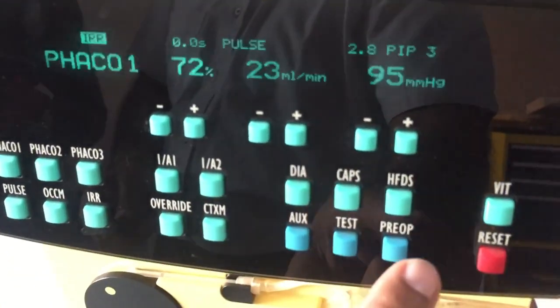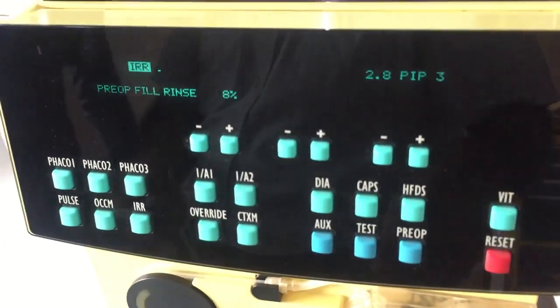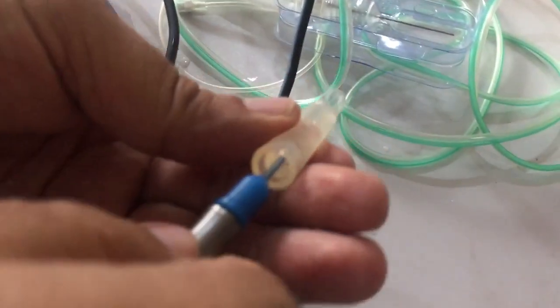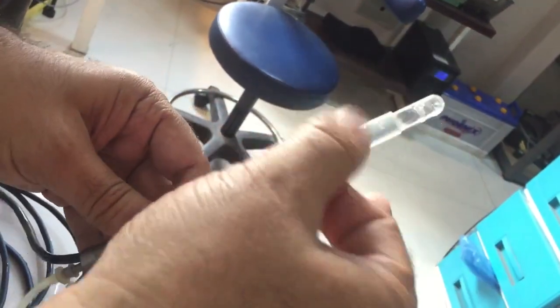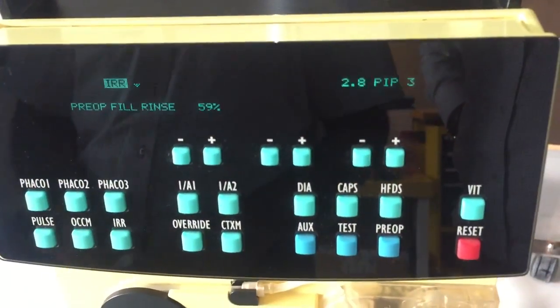Then you open the clamp for irrigation, and then you press the phaco 1 and then the pre-op button here. The system will run. It will fill and rinse all the tubing, and you can see the water coming into the chamber. You fill the chamber and then you mount it, and you take all the air from the handpiece into the chamber. You knock the handpiece in this vertical direction, and then you wait until the system shows the message OK.